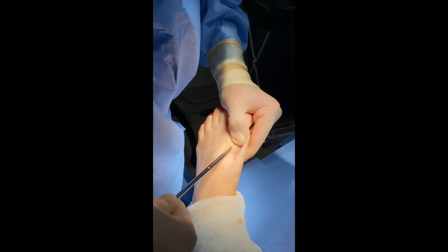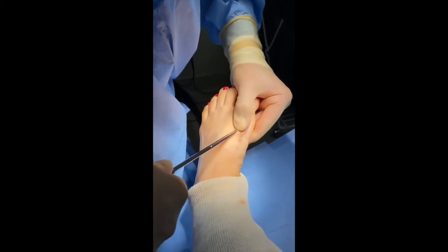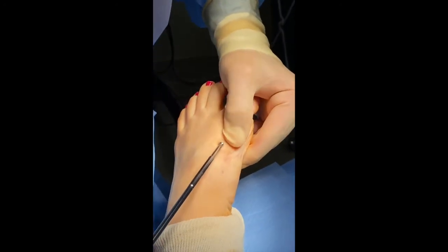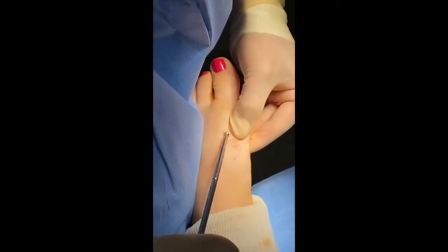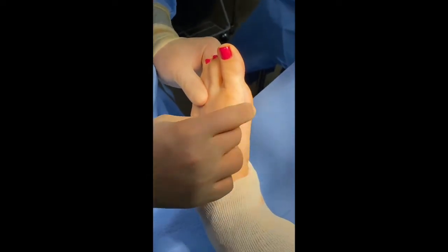We will engage the screw, rotate it counterclockwise, and the screw will emerge through the skin as you see right there. We'll slowly back it out, and then once the screw is out we'll grab it with our hand and slowly wiggle it out of the foot.